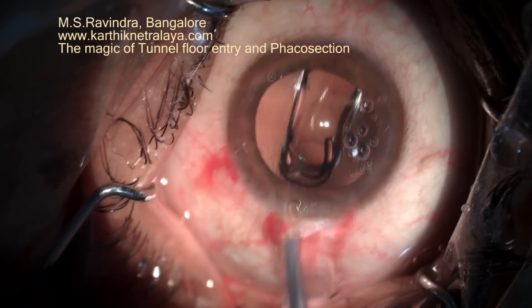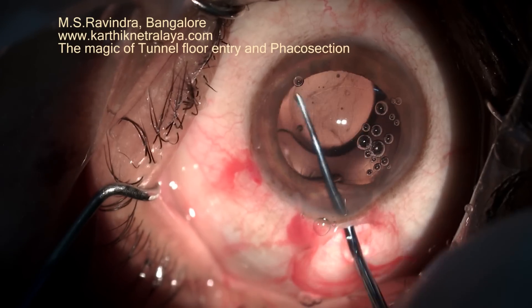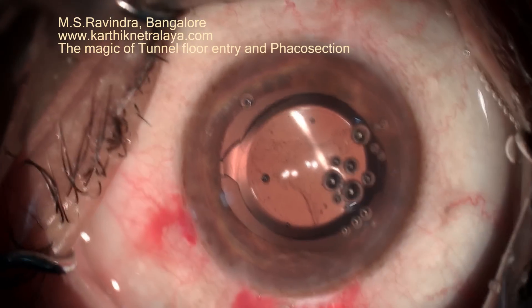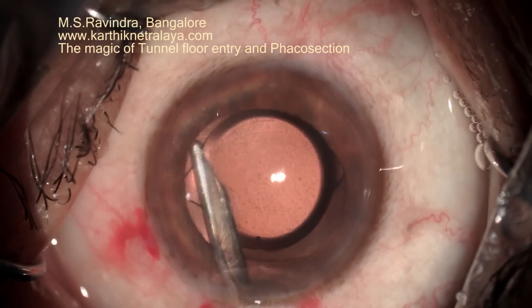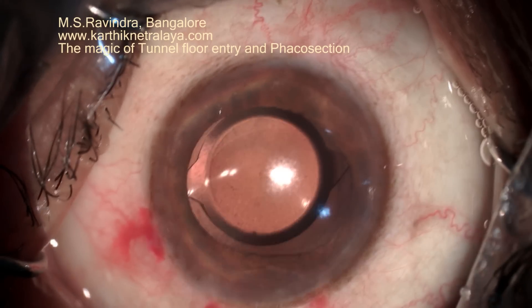As you can see, it is not an injector — it is a thick-bore, long cannula. A long needle or rod pushes the lens into the capsular bag. The lens is positioned, and the entire viscoelastic in the anterior chamber, behind the lens, and in the capsular bag is aspirated.